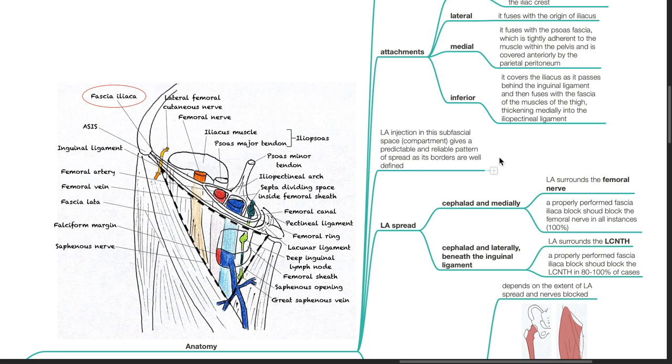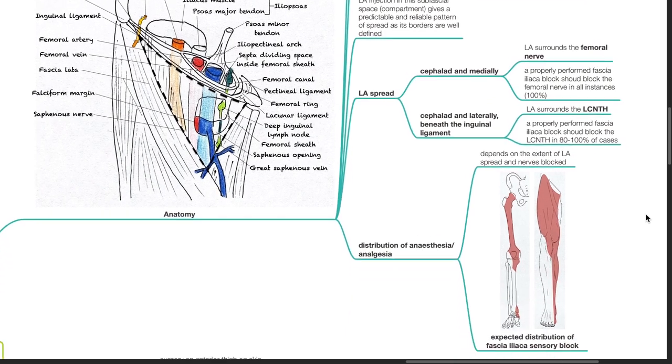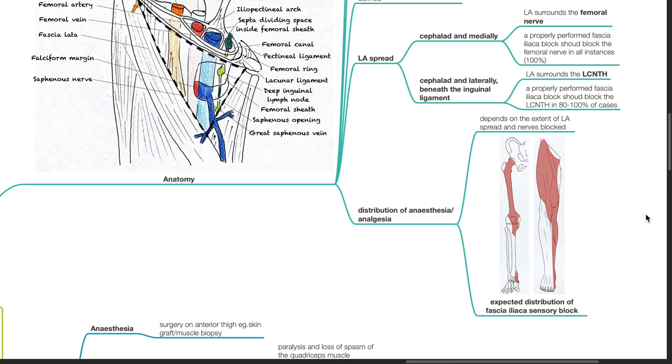LA injection in this subfascial space gives a predictable and reliable pattern of spread as its borders are well defined. LA spreads cephalad and medially, and will surround the femoral nerve. A properly performed fascia iliaca block should block the femoral nerve in all instances. LA spreads cephalad and laterally beneath the inguinal ligament, and will surround the lateral cutaneous nerve of the thigh. A properly performed fascia iliaca block should block the LCNT in 80 to 100% of cases. The distribution of anesthesia or analgesia depends on the extent of LA spread and the nerves blocked. This diagram shows the expected distribution of fascia iliaca sensory block.